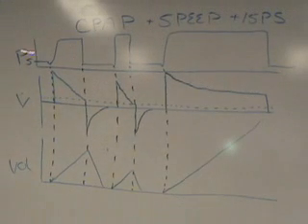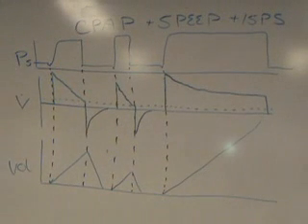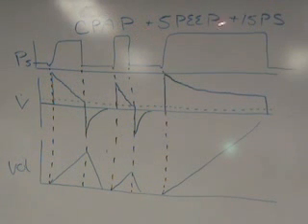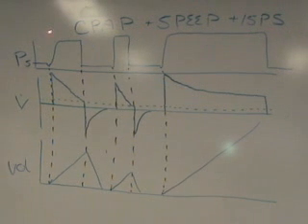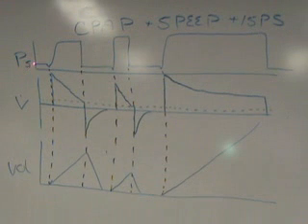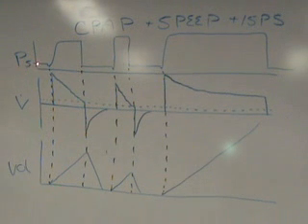Okay, so here I've drawn a pressure time, a flow time, and a volume time scalar for you in the mode of CPAP with 5 of PEEP and 15 of pressure support. If I take a look at the pressure time scalar first, you see that I have my baseline pressure at 5, and the baseline pressure stayed the same until the patient started to inhale.